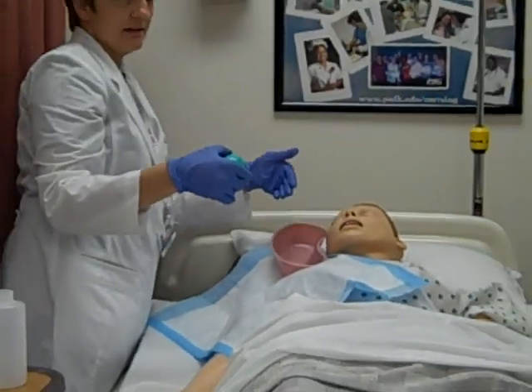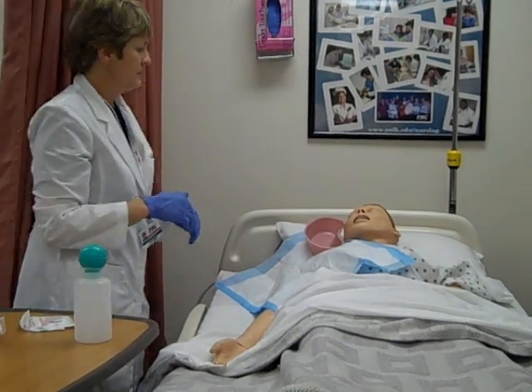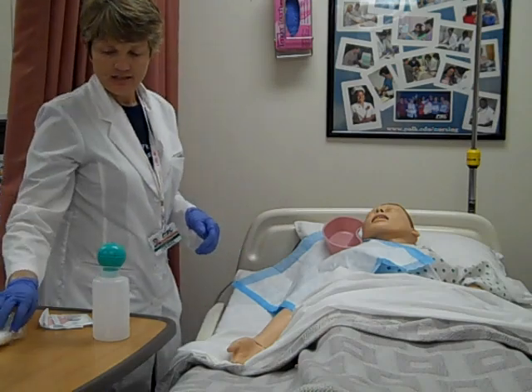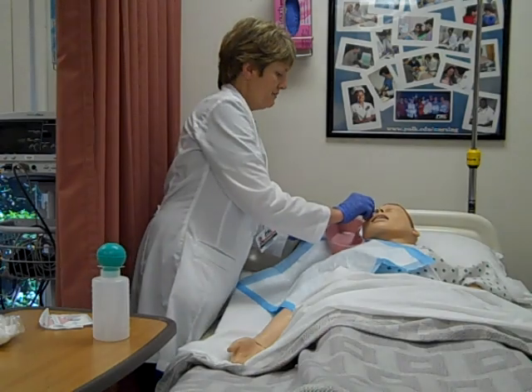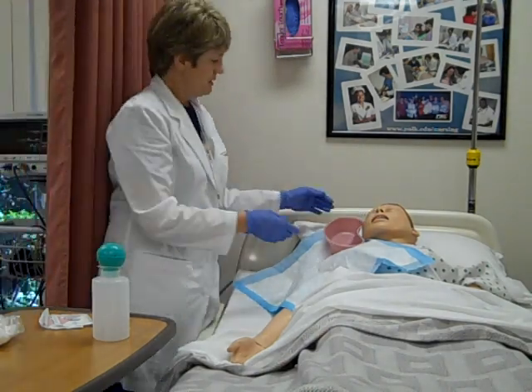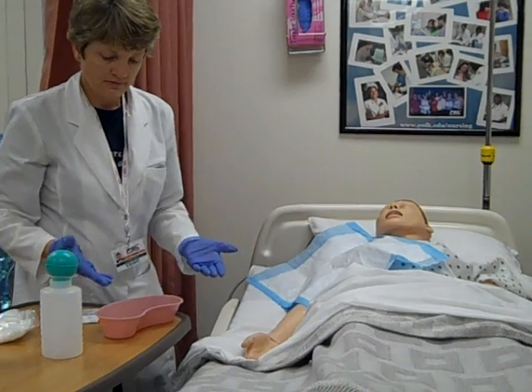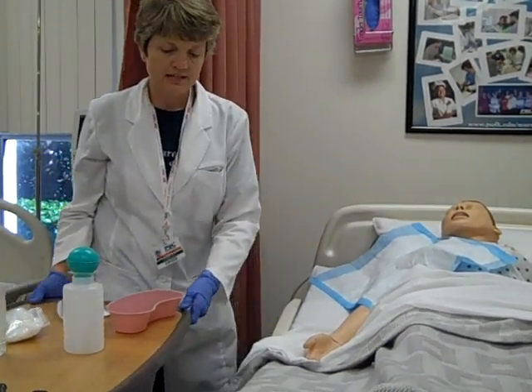At the same time, the solution can be draining down into my basin. I'm going to irrigate as the doctor ordered. When I'm all done, I can take another sterile cotton ball or gauze pad, pat it dry, and wipe it again from inner to outer. Then I'll take my basin and look to see what kind of return I got — if there was anything in it. If I noticed anything, it would have to be documented.